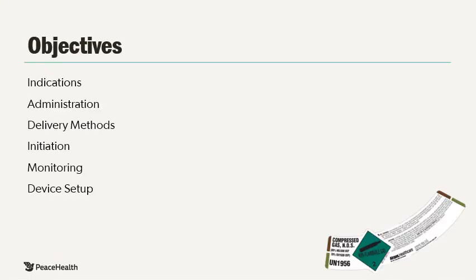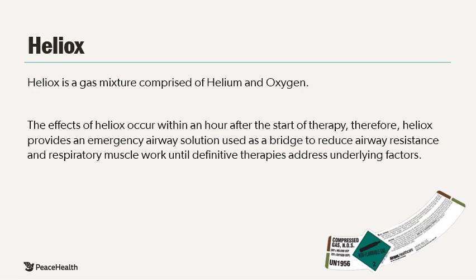Our objectives for this presentation are to go over indications for therapy, the type of gas we will be administering, how we can administer said therapy. We'll also go over initiation and monitoring, and last, how to set up our delivery devices.